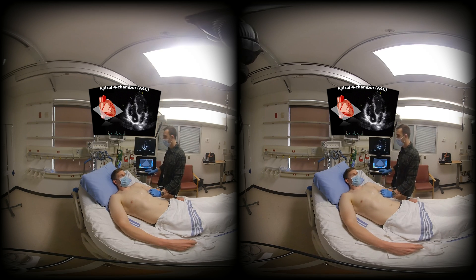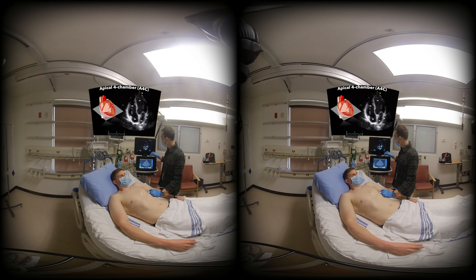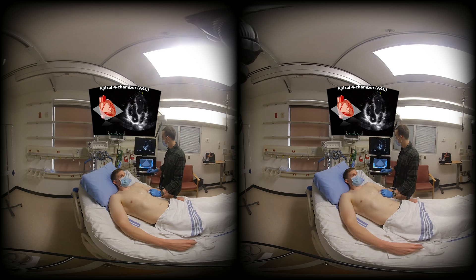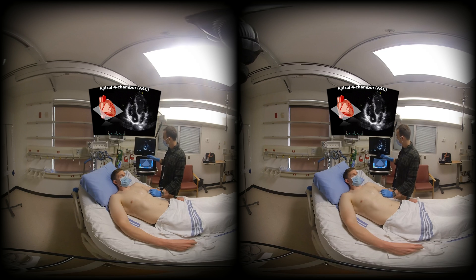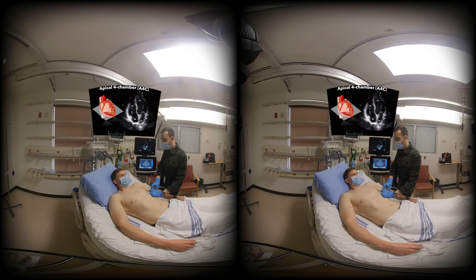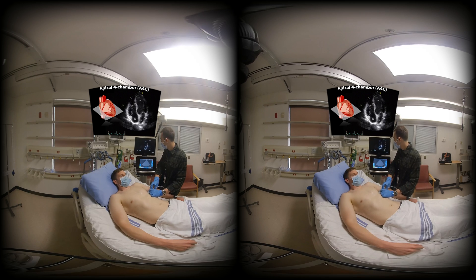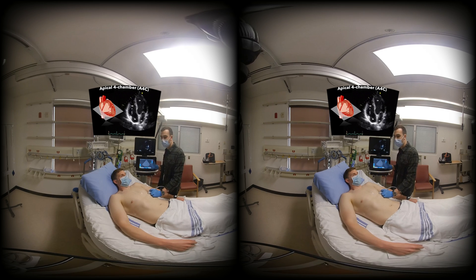One thing to note about the apical view is that it's very easy to flip into a five-chamber view. Here I'm able to see a structure coming off the left ventricle towards the middle of the heart — this is the left ventricular outflow tract and aortic valve. If you see this view it's not ideal for assessment of function, so you want to try to clean that up. Most of the time it's a slight counterclockwise rotation and an angulation of the probe either towards or away from the patient's shoulder to close that off. The left ventricular outflow tract can be very useful for Doppler measurements and assessment of stroke volume, but that's a bit more of an advanced topic.